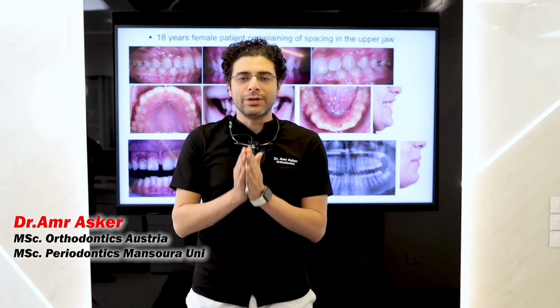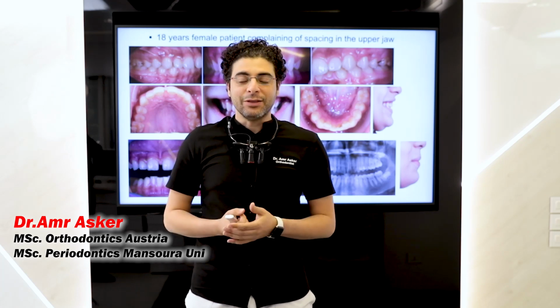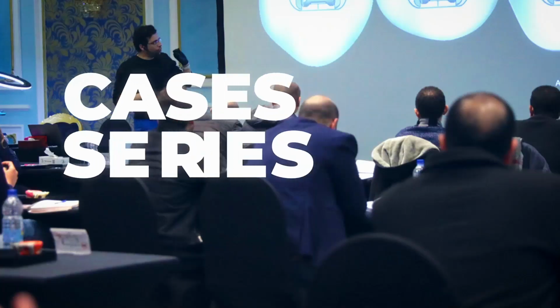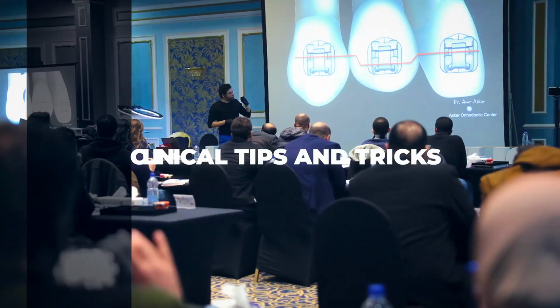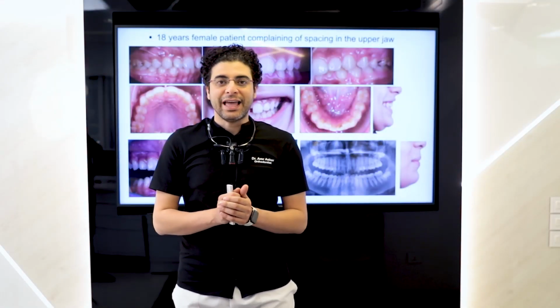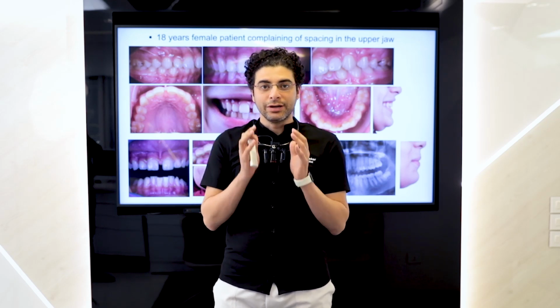In this episode, we will discuss cases from A to Z, how to plan, and what happens during the treatment plan. The first case we will discuss today has spacing in the upper dentition and lower incisor crowding.